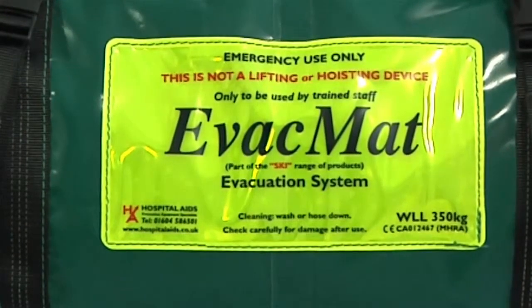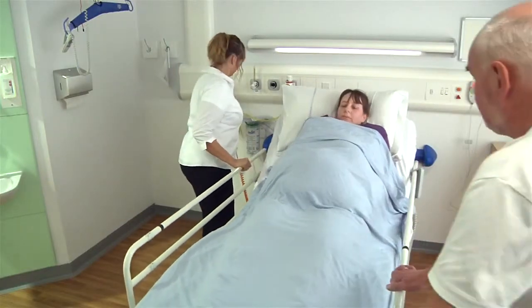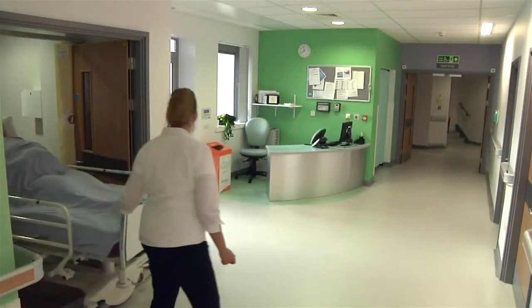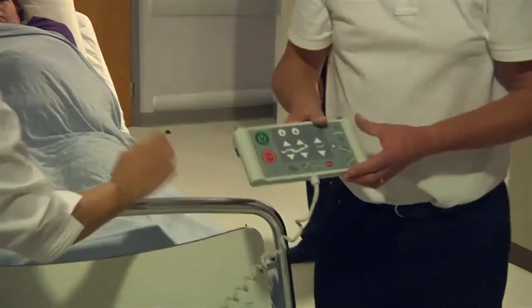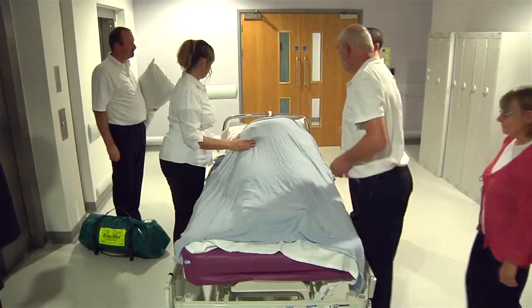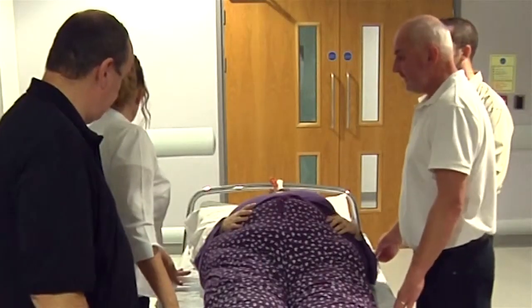In an emergency, the evac mat can be carried to the evacuation location by the carry handles. In some instances, the mat is located with the bariatric bed at all times. To reduce the physical effort of the carers, moving the patient as close to the exit or stairs as possible on their bed is strongly recommended if space allows. If time allows, always work with the bed at a comfortable height. One person should take a lead role to ensure communication throughout the process is clear and effective.